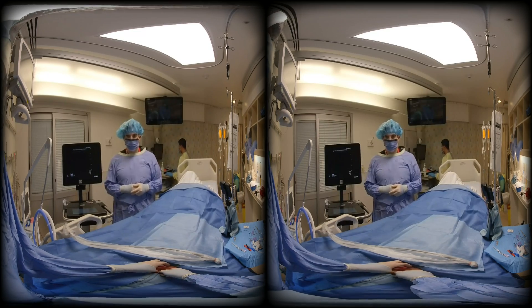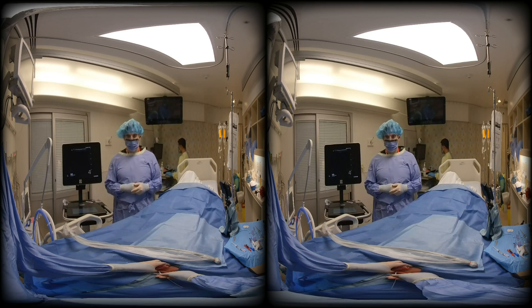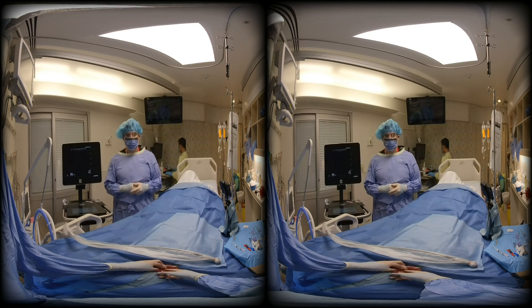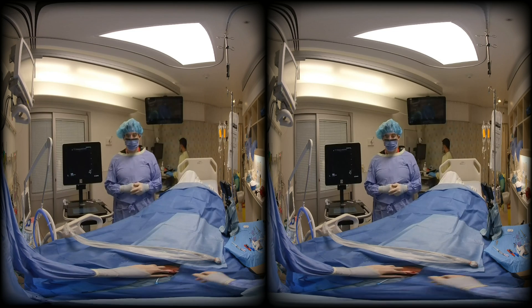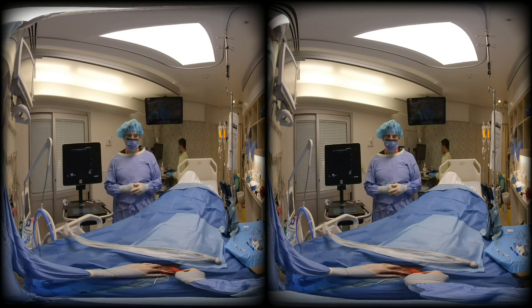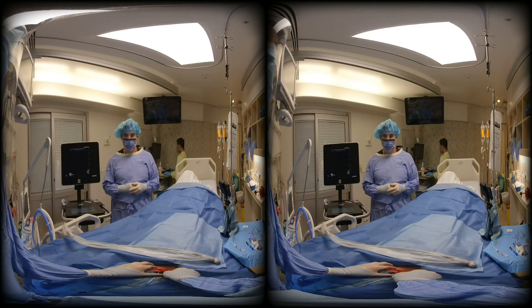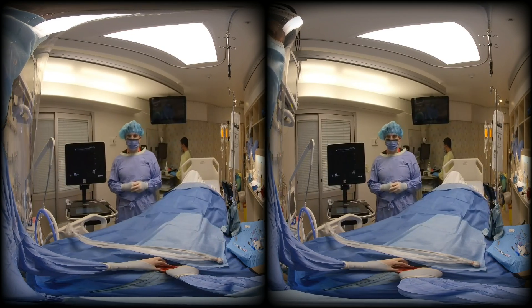I noticed you are having some difficulties with the incision. This is a very common issue when approaching a central line — determining how large the incision should be. I see you are further extending that incision.